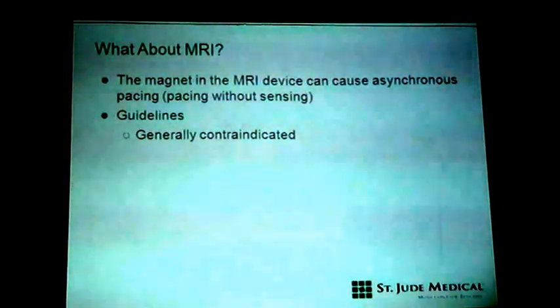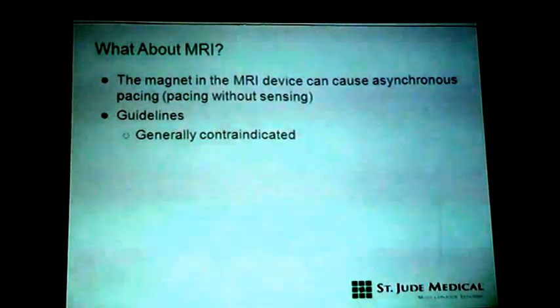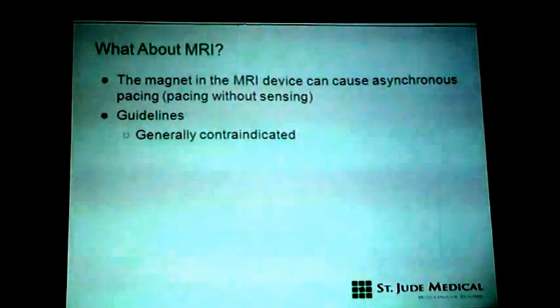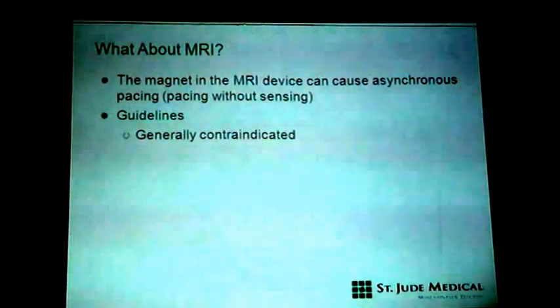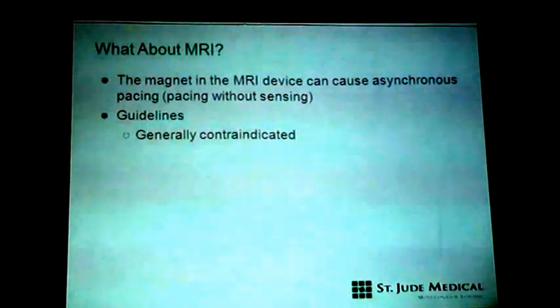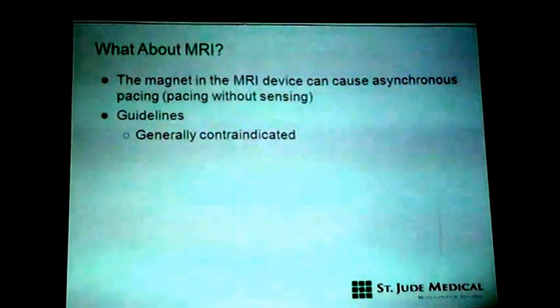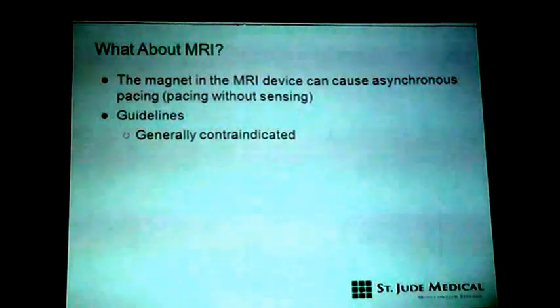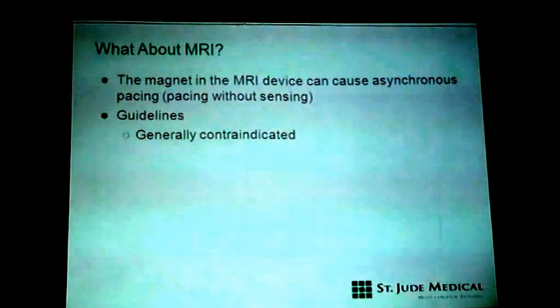Since she is a swimmer, bradyarrhythmia is sometimes a major problem in athletes. But with a pulse of 40, 50, she refused any type of pacing, saying it would hamper her career and that she was all right. She had one episode of syncope, but then on return she was fine and refused to operate. But in that type of patient selection group, where there is a major chance of needing MRI in future, the MRI resistant pacemaker is now a new option.